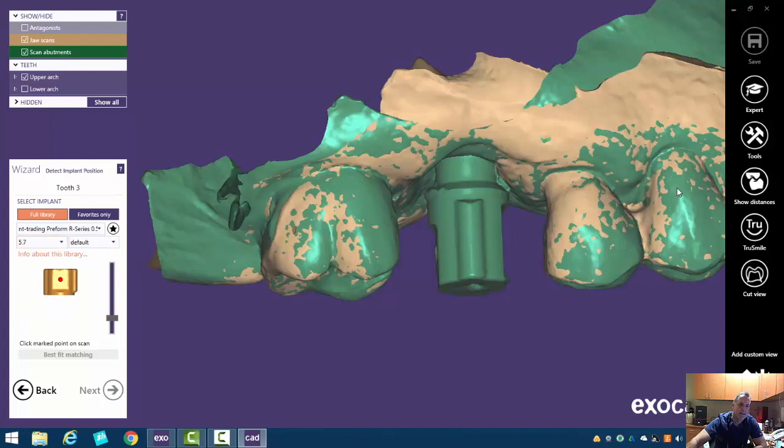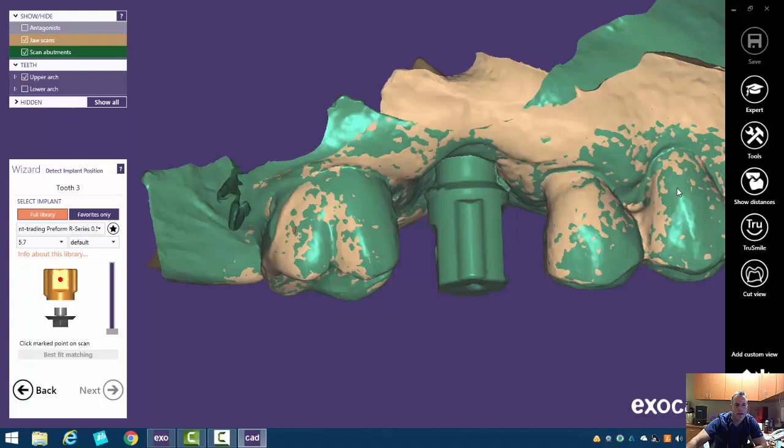This is for a Legacy 2 implant. And see this little slider? The slider is looking for stuff. You might see this little tie base in there. We don't need that. We're just looking for the scan marker.